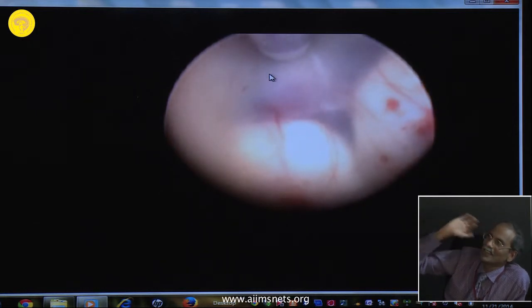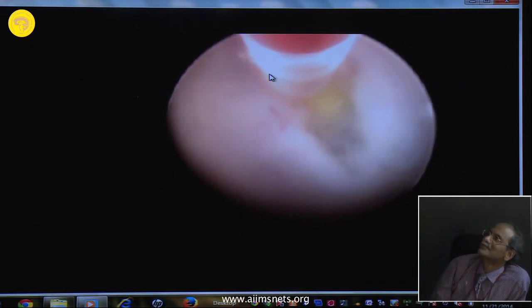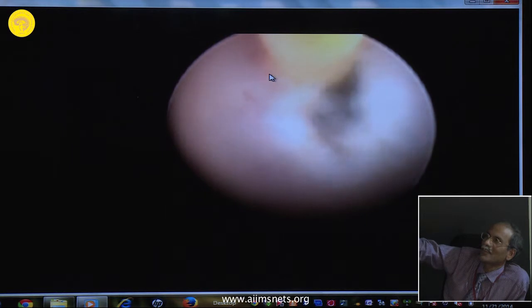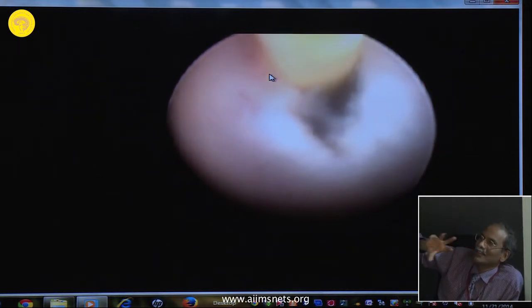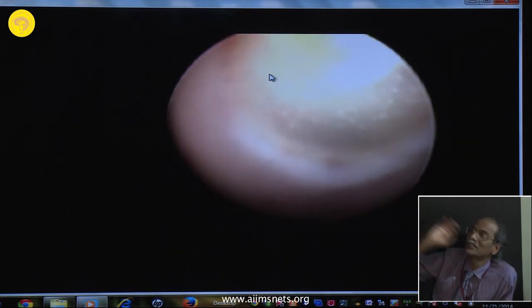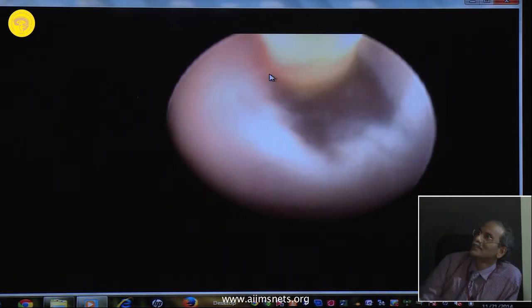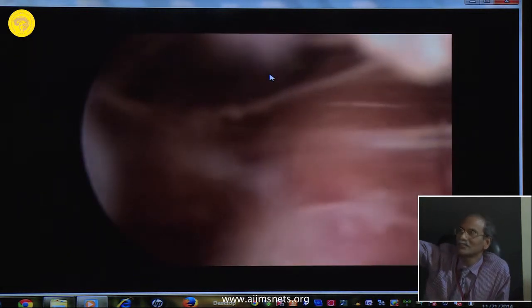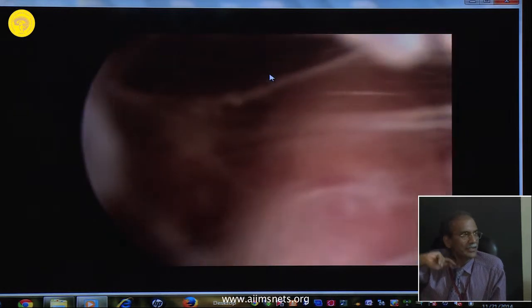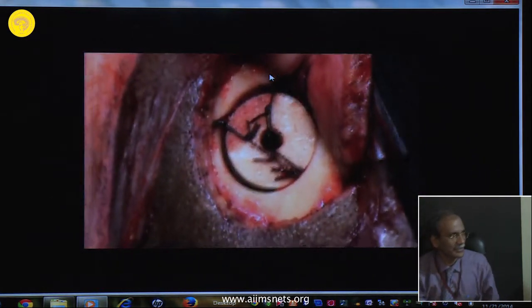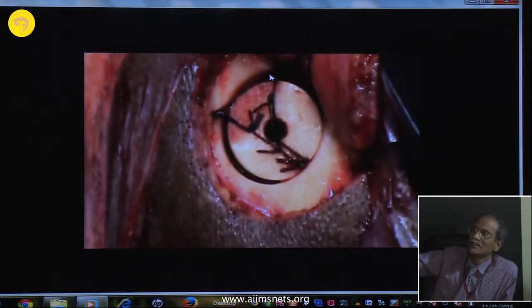Subsequently I also did a third ventriculostomy. When we are inside, after perforating the floor, we should not increase the balloon size, as that causes rupture of the vessel. We should be very careful when inflating in that space. Once you start visualizing blood vessels, it means you have ruptured the Liliequist membrane. If you do not rupture it, you will never see the blood vessels. Sometimes the anatomy of the Liliequist membrane is different — sometimes it will already be perforated.